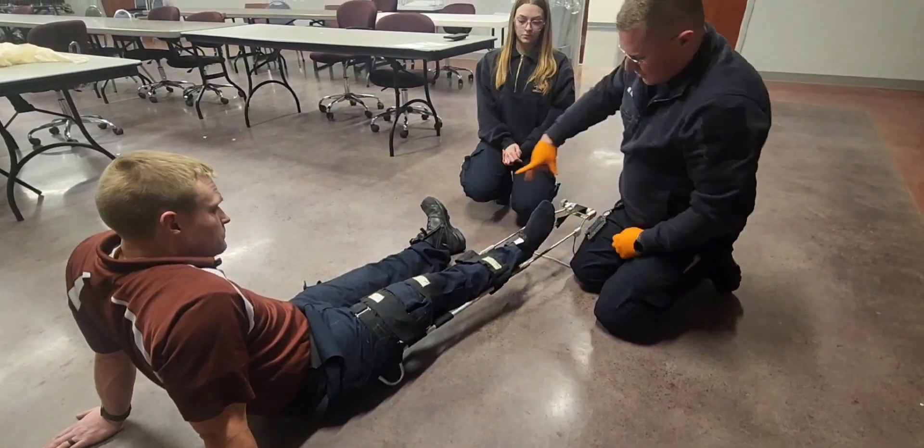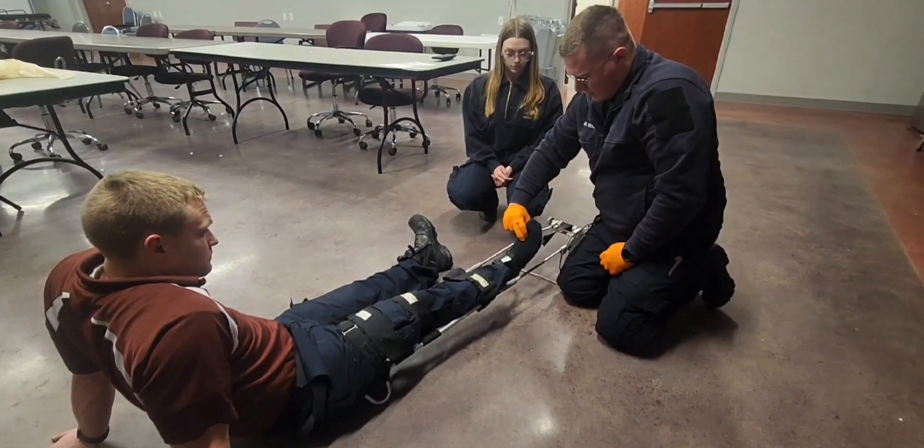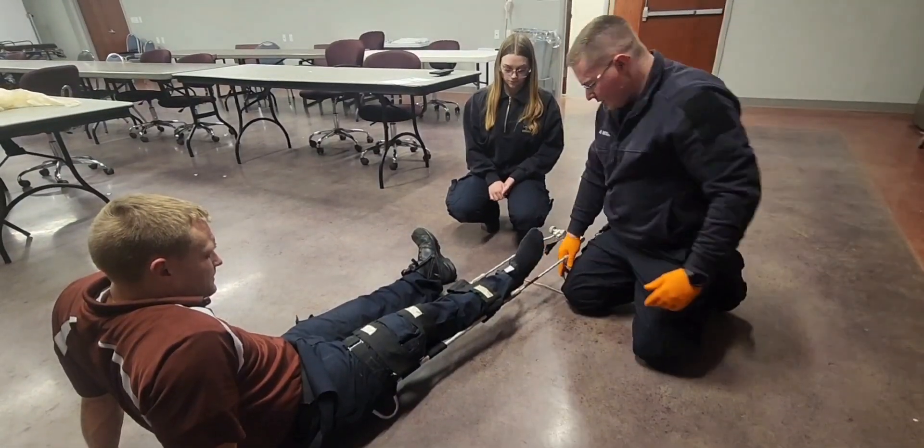I'm going to reassess my sensory, motor, and circulatory functions. We have a strong pulse. Move your toes for me. And close your eyes. Inside or outside? Outside.